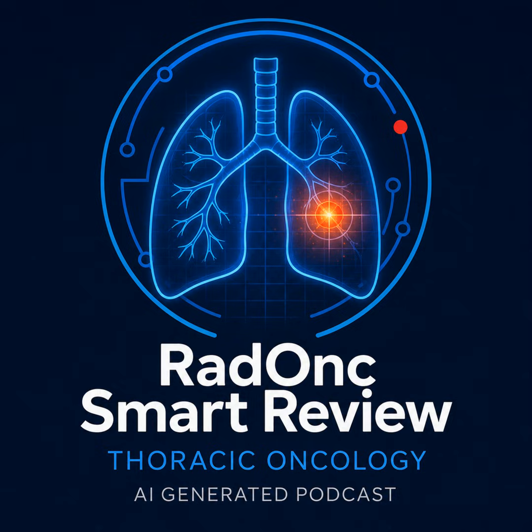A patient rarely, if ever, arrives with this perfectly curated set of scans that cleanly answers every single staging question we have. Yeah, that is exactly what happens in the real world. I mean, the contrast-enhanced CT might give you this beautiful high-resolution anatomic definition of the primary lung mass. Which is great. But then the PET scan reveals intense uptake in a mediastinal node that measured totally normal by size criteria on the CT. We see that weekly. Or a routine staging brain MRI catches a 3-millimeter asymptomatic finding that completely derails the entire M category.